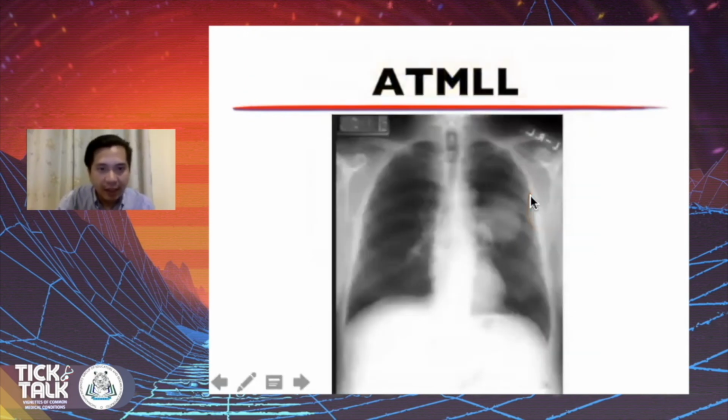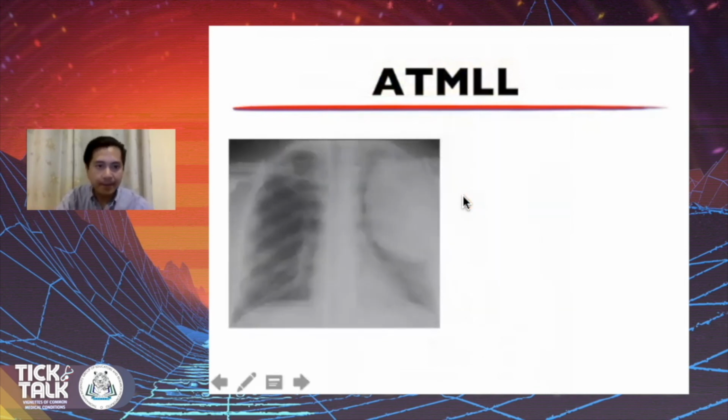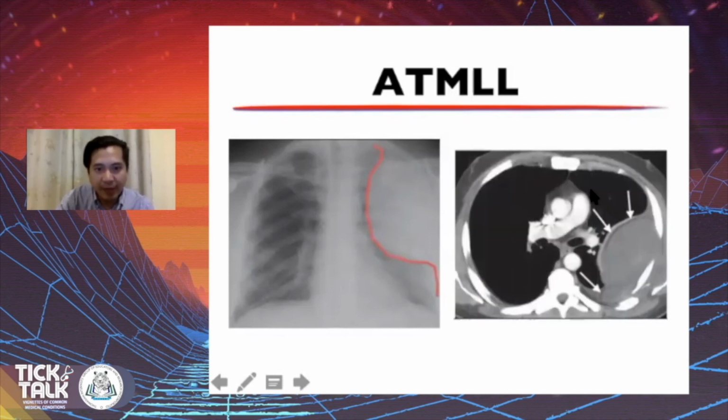But if you have an acute angle, if you draw an outline on the lesion and the angles are acute, it is parenchymal. Or this one. The angles are obtuse, so most likely the lesion is pleural based.